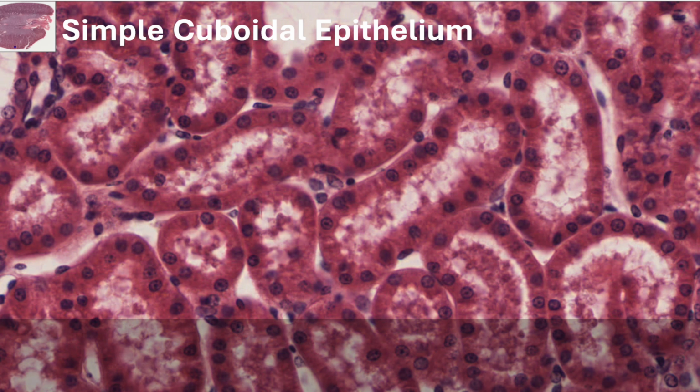In simple cuboidal epithelium, cells are about as wide as they are deep as they are tall. The nuclei are centrally positioned in the cytoplasm and appear mostly spherical. Here you can see that there are definable tubes of simple cuboidal epithelia that contact each other. Points of contact are where we will find basement membrane joining the layers, but this is not stratified.